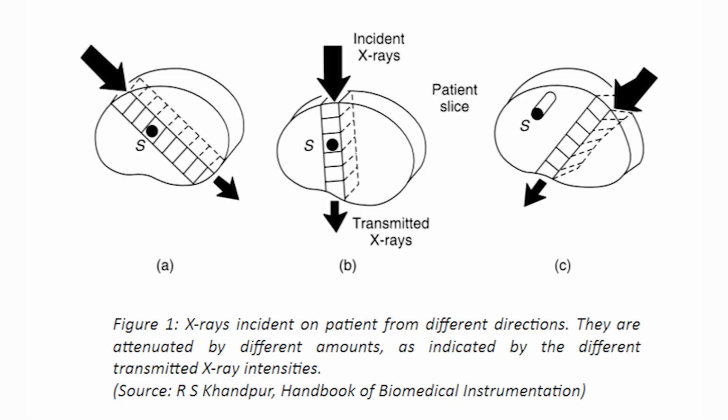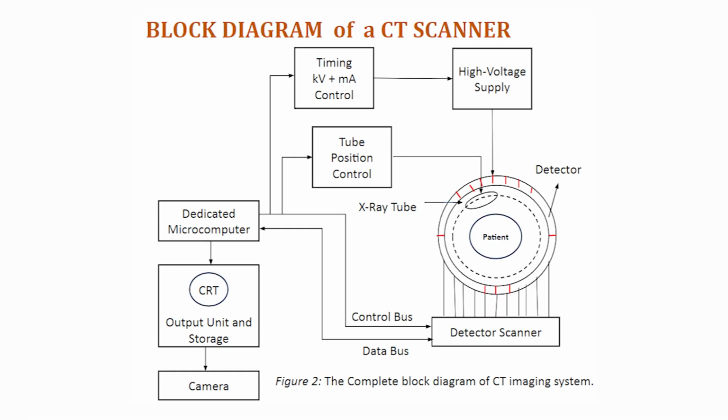Now, next I am going to explain the basic technique and block diagram of a CT machine. Figure 2 shows the complete block diagram of a CT imaging system.